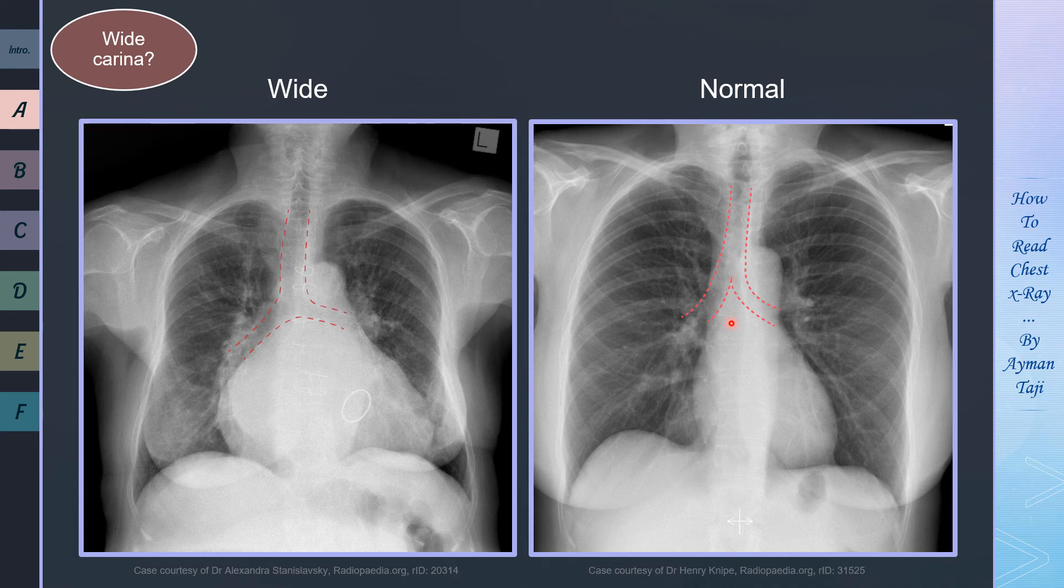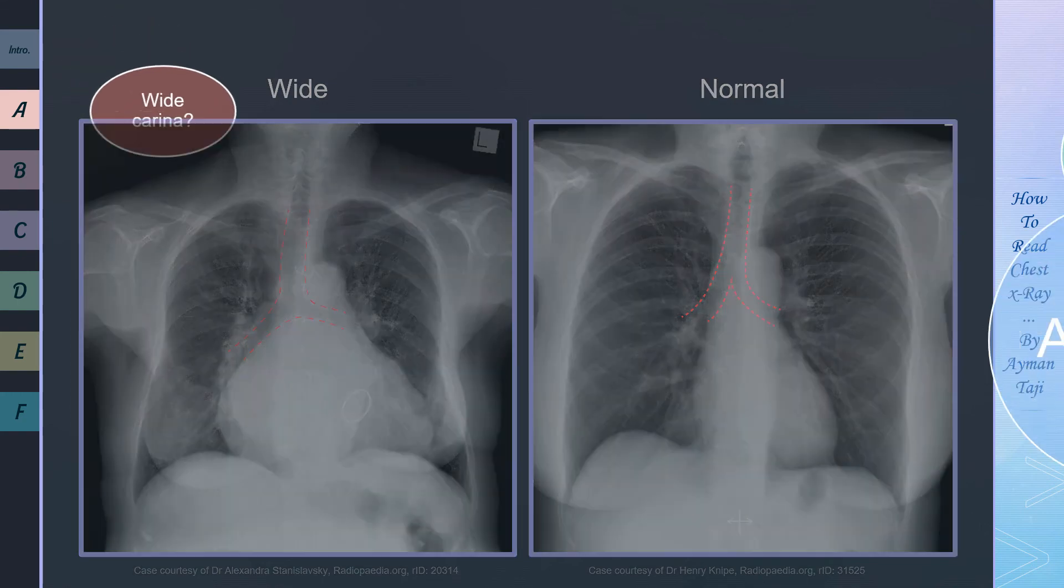Now what are the causes of a widened carina? Actually there are many conditions like a mass under the carina or left atrial enlargement as in this case here, but this sign is of poor diagnostic value due to the lack of sensitivity and specificity in identifying the underlying pathology.